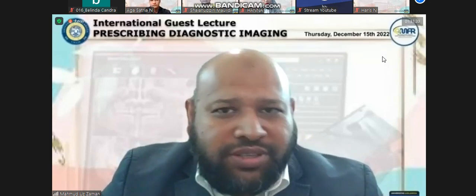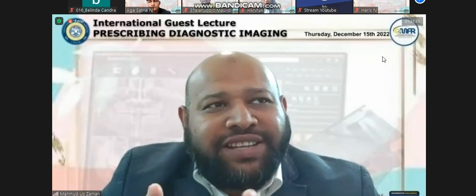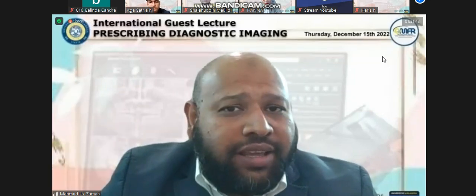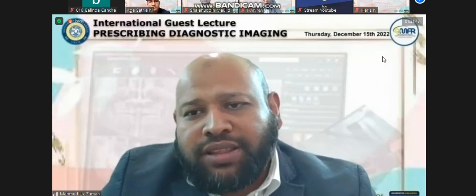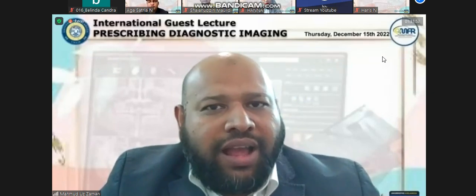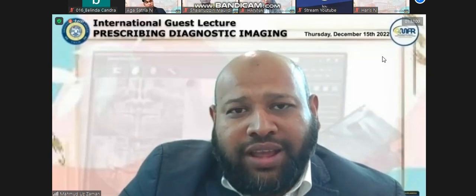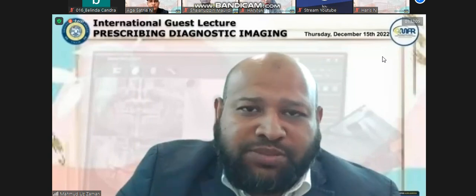So you may expose children multiple times, but for children it is not recommended, especially 3D views, CT or CBCT. Especially for the panoramic radiograph, it is better not to expose them under 5. And for CT and CBCT, again I come to the same point, risk versus benefit. If it is necessary, you will expose this patient.